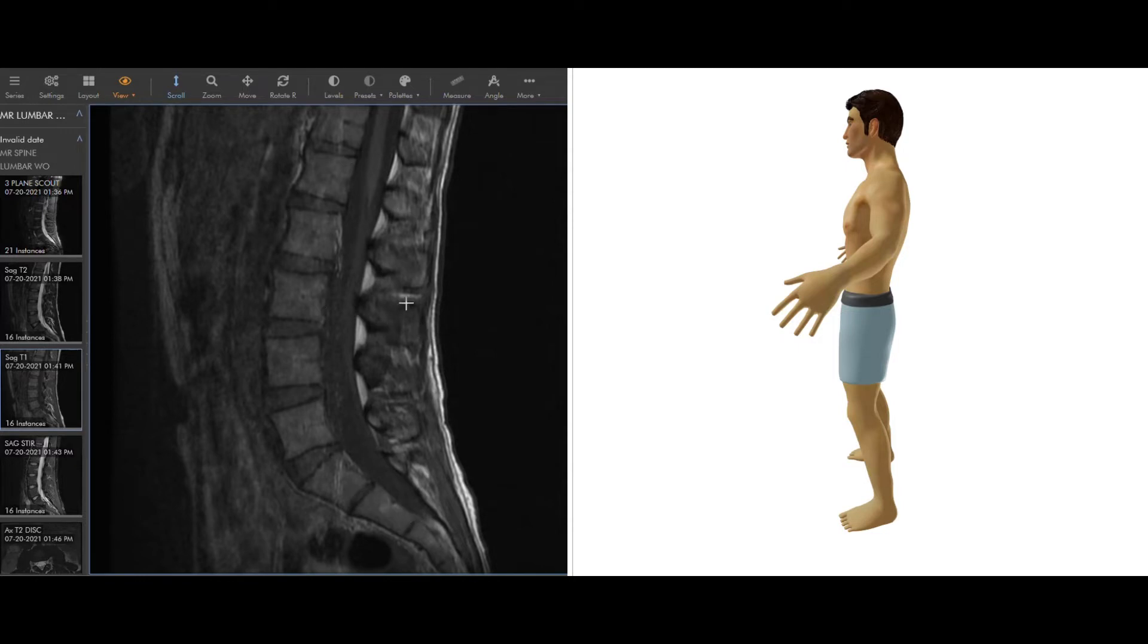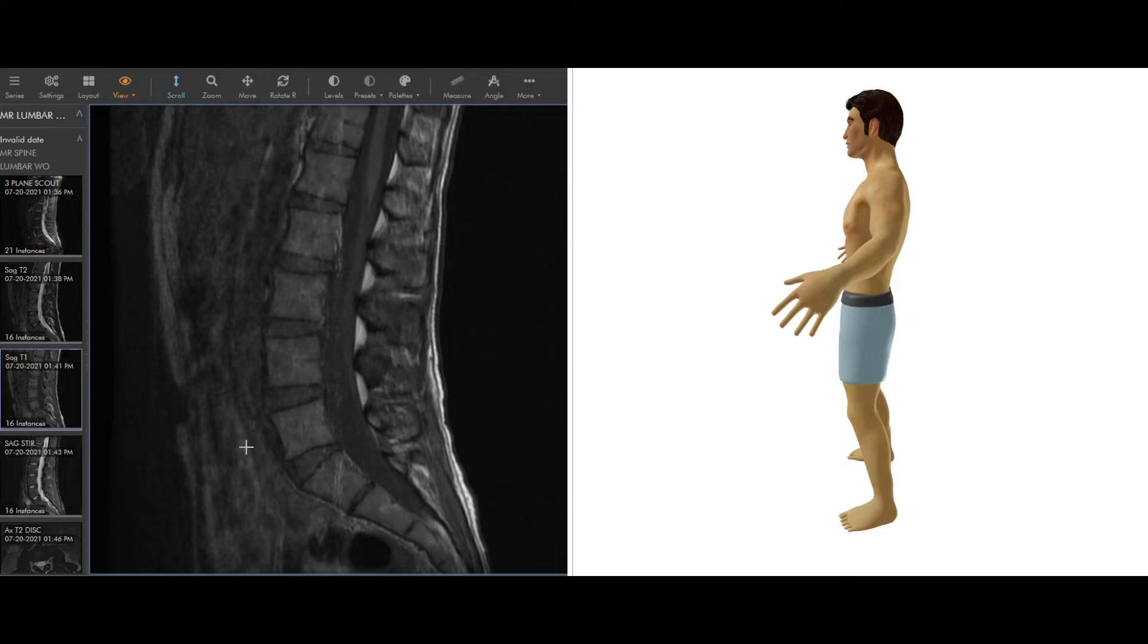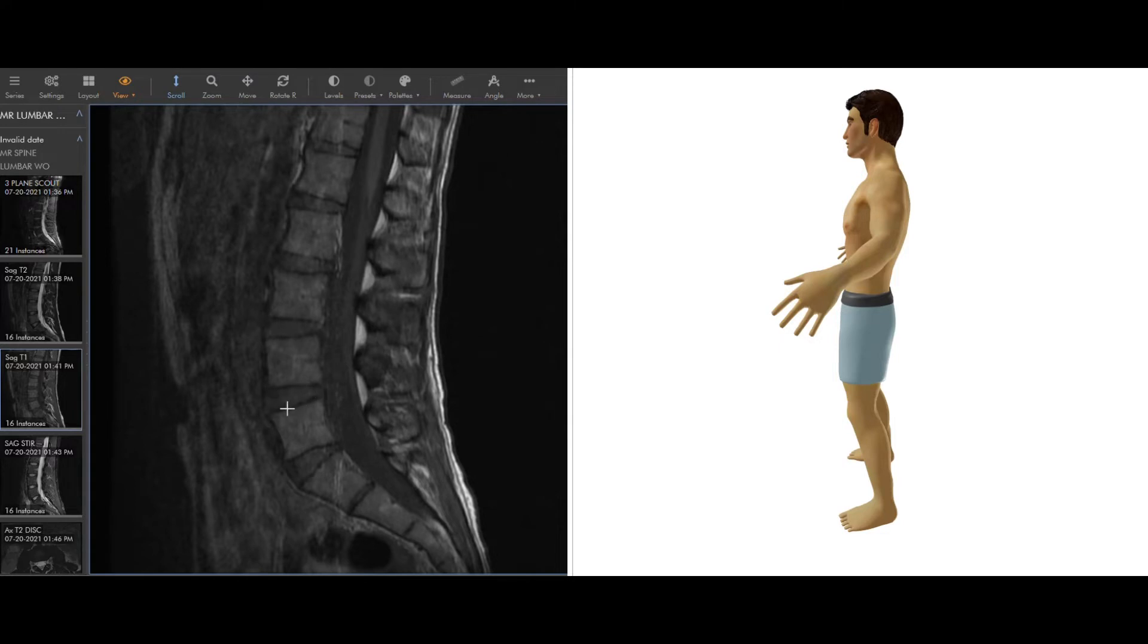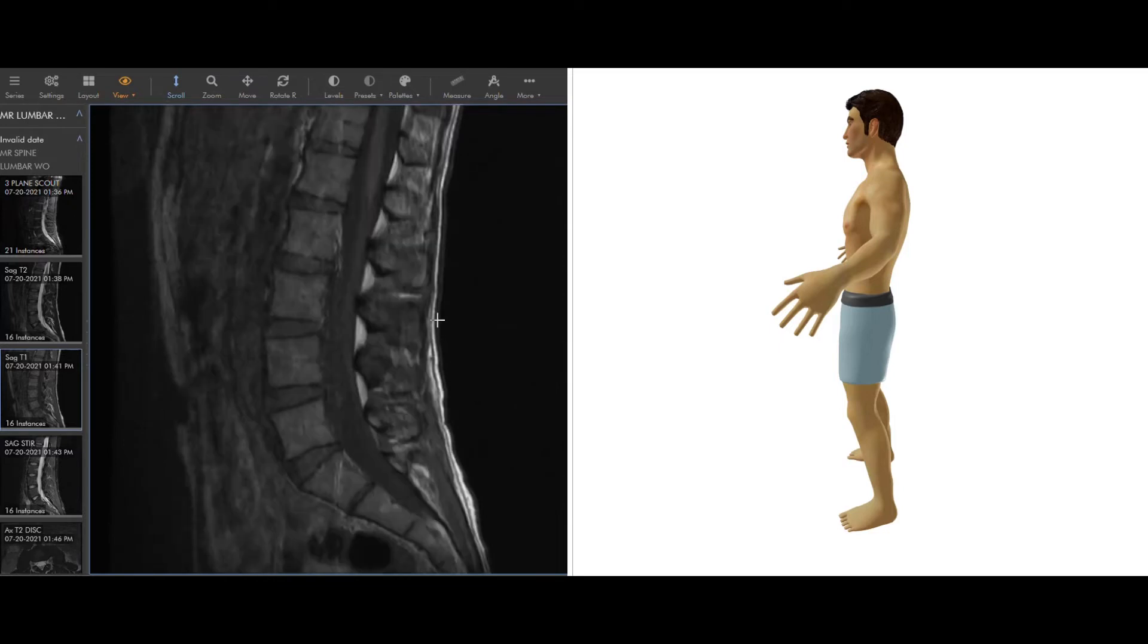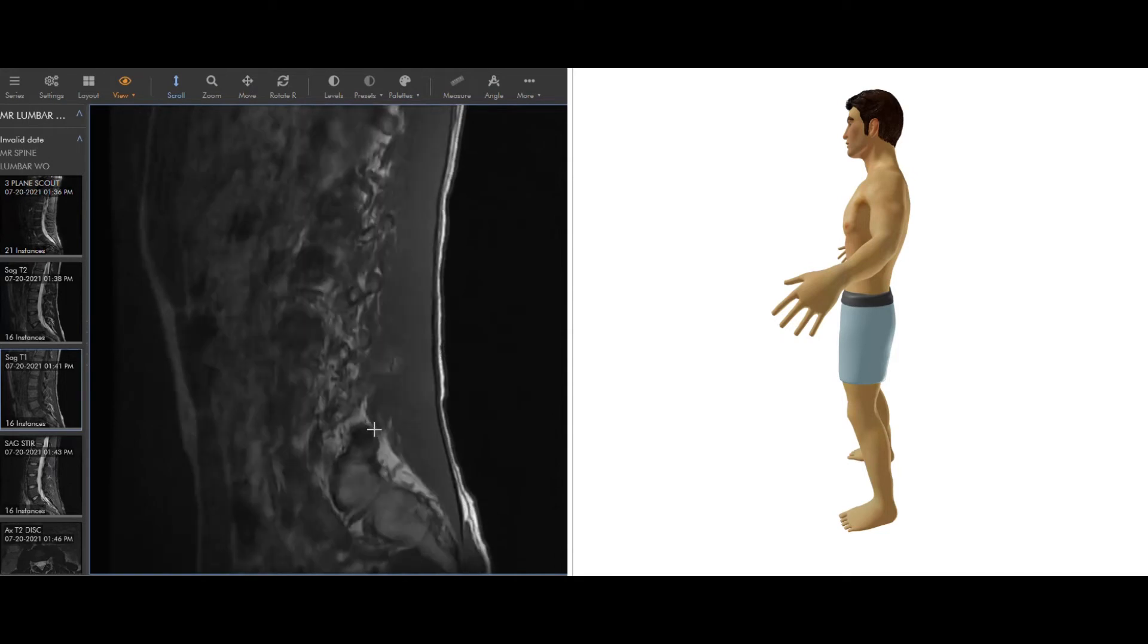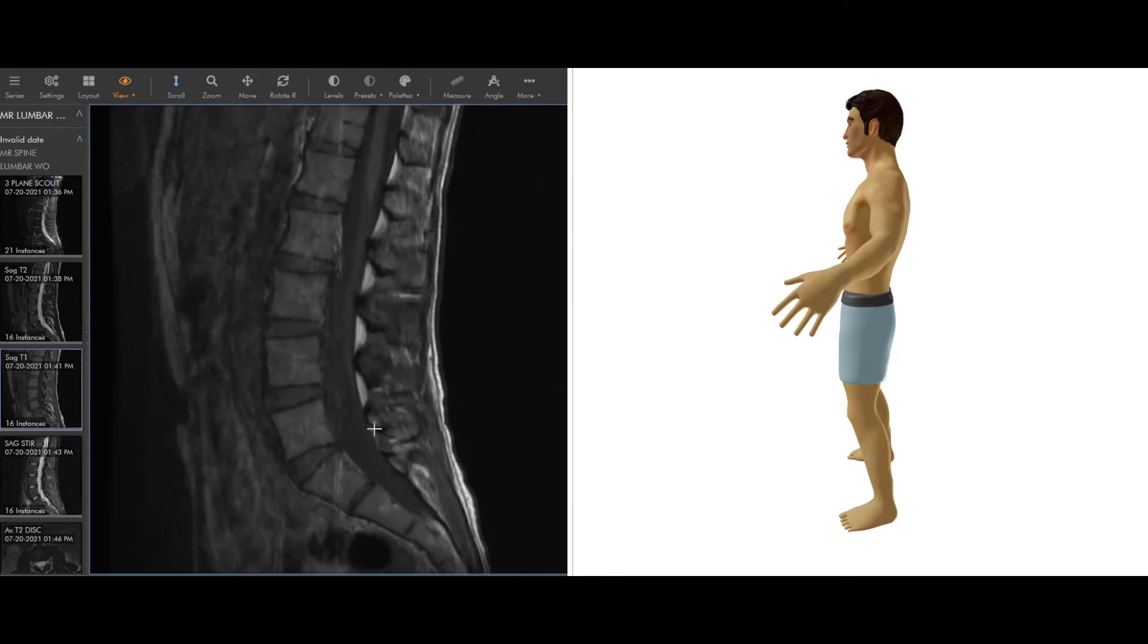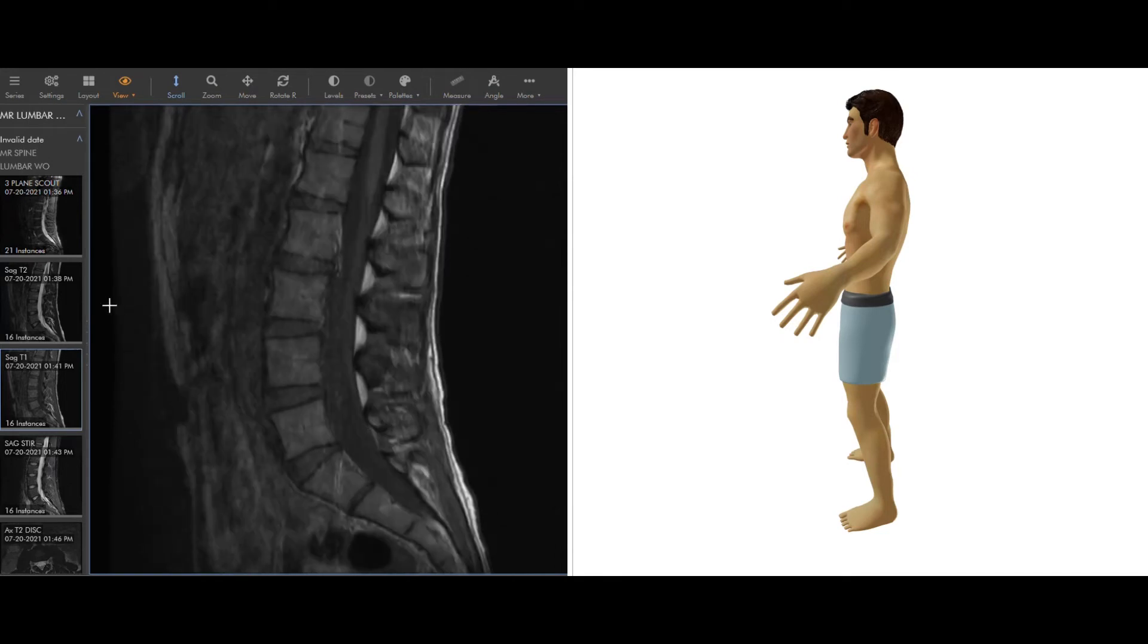T1 images are known to be good for looking at anatomy. In T1 images, fluid is always dark, muscle, soft tissue, and organs are going to be this dark gray color, bones are a little bit lighter gray, and then the edges of bone, which is the strongest part of the bone, the cortical bone, that's going to be black. Discs, intervertebral discs, are also gray. So T1 images, as you can see, especially in the spine, are mostly gray. This white area here, this is fat. That's one thing that is bright on T1 images.